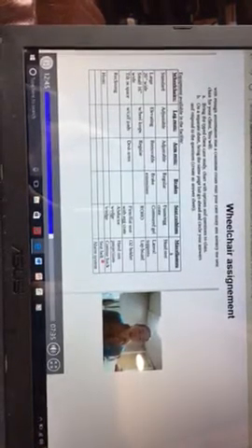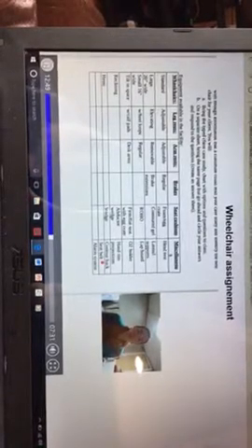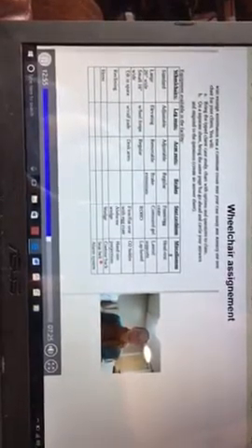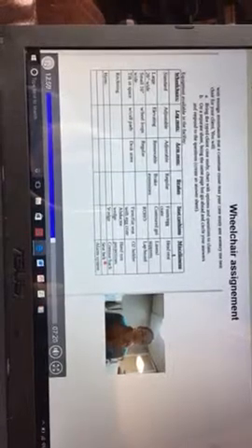A seatbelt. Personally, this is my thought on seatbelts: if you have anybody who's going to use a wheelchair in the community, they need to have it on. However, if you're in a facility, you can't use seatbelts because they're considered restraints, so you have to have a doctor sign off on it every 24 hours. But if you're a full-time wheelchair user, what I've always done is say that if you're using it in the community, you need it.